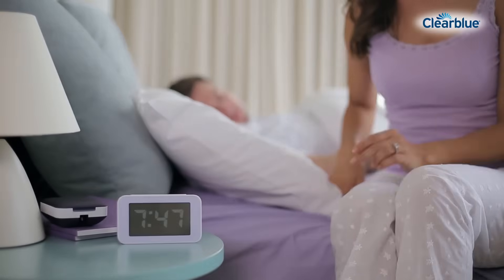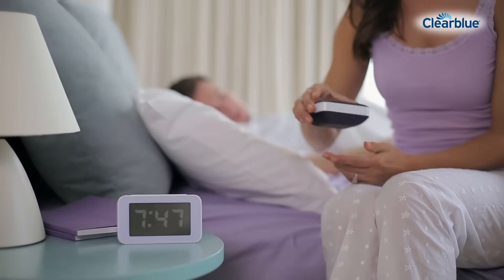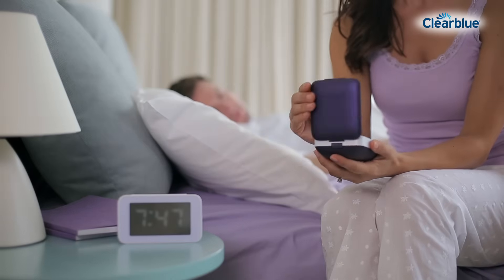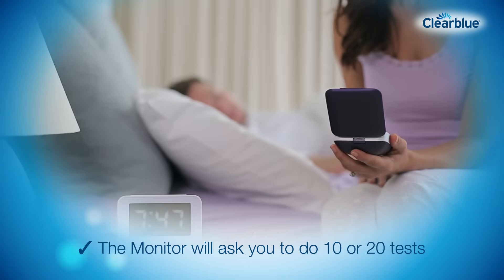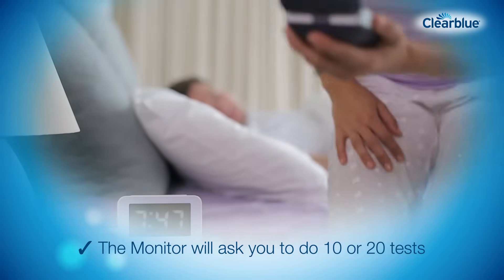Switch on your monitor every morning within the testing window to check if the monitor is requesting a test. The monitor will ask you to do 10 or 20 tests each cycle, depending on your cycle length and variability.